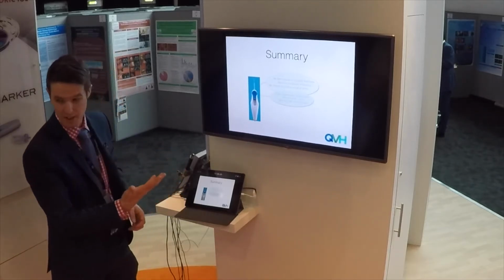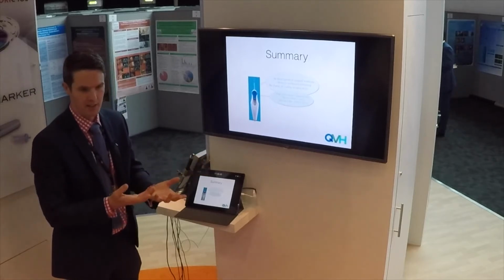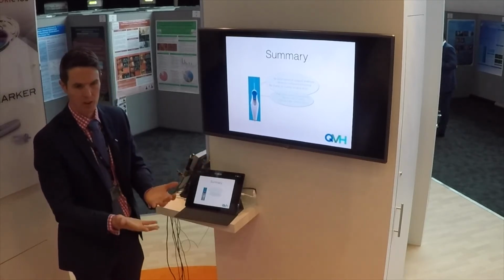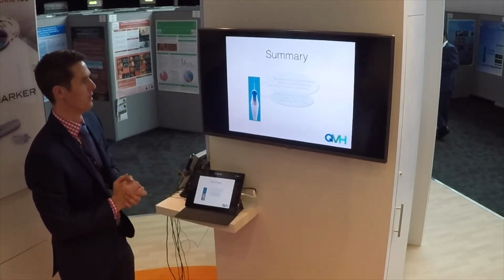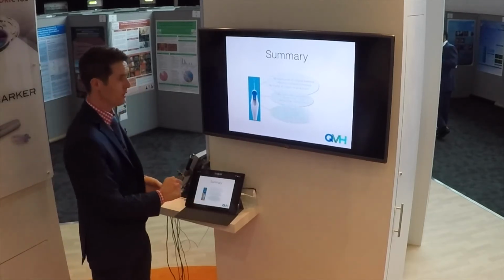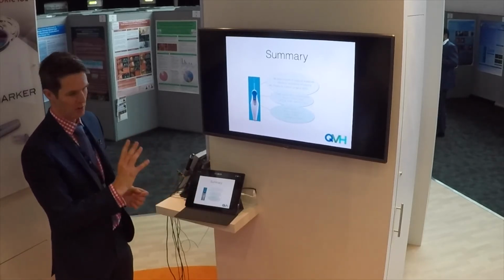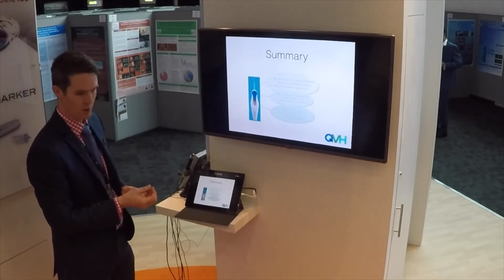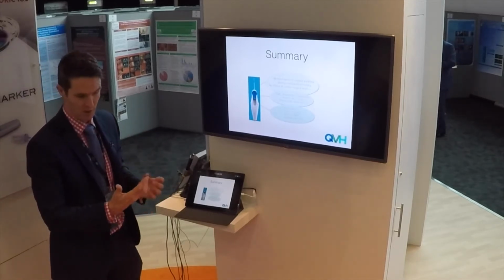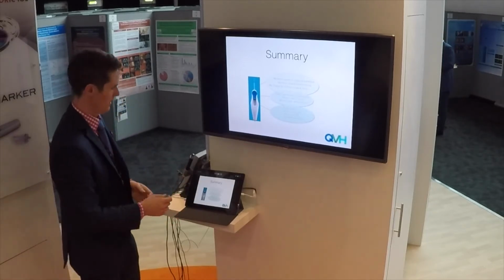It's fast. It doesn't take very long at all. So does it add to the workflow? No. I would say that once you get slick, it's the same, if not a bit quicker than just doing your manual capsulorhexis. So it's not adding any time to the whole procedure. And you get the ideal size each time. You can use it on small pupils, you can use it on dense cataracts, you can use it on weaker zonules, you can use it where there are corneal opacities, which I've done, because you've got confidence that it's happening underneath.